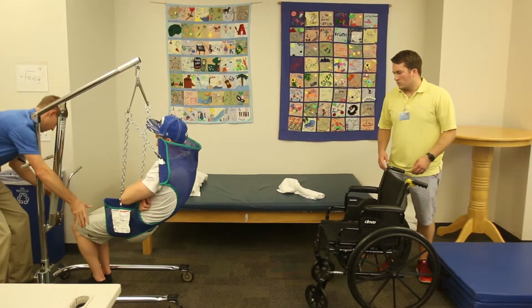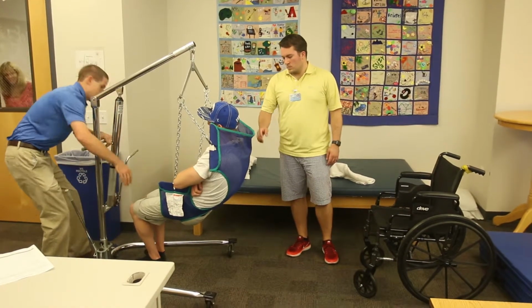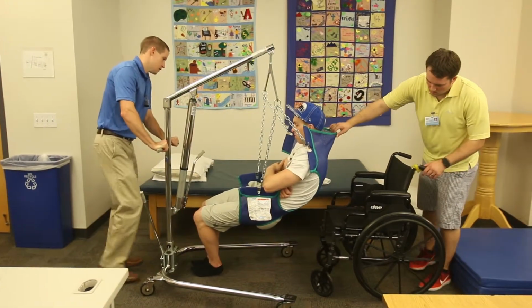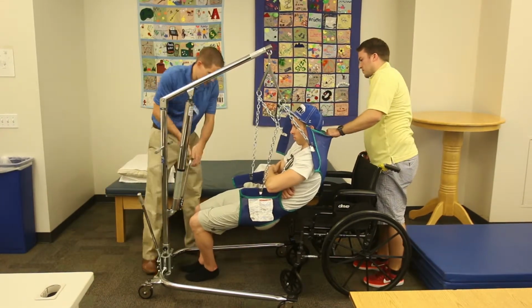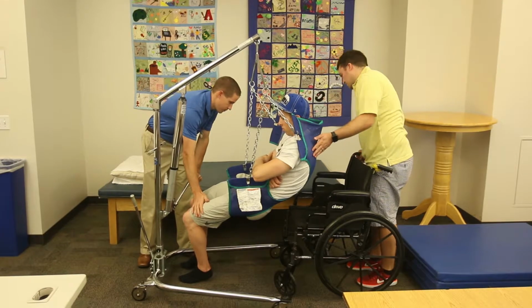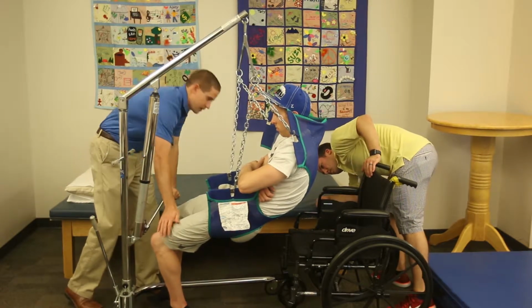Okay. I'm going to bring these wheels out just a little bit wider. Get around your wheelchair. Okay. Now keep them straight back there for me. We're going to go right back to that chair. Do I need to raise his bottom up just a little bit? Yeah. Okay. I'm going to bring you up just a little bit more, dude. There. A little bit more. All right, that looks good there.